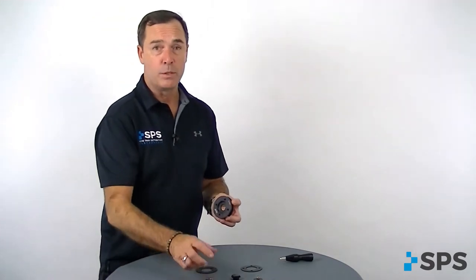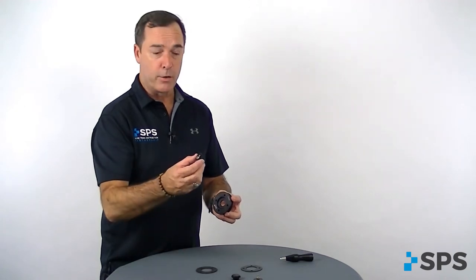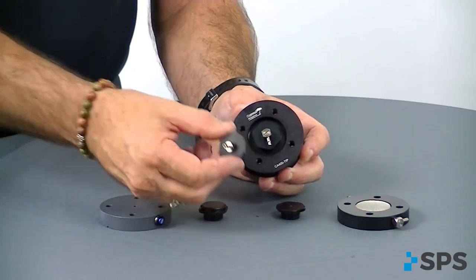You also have two choices of barbs that will go along with whatever endoskeletal components you would use. You've got a 90-degree safety barb — the insert would screw in, and the neat thing is the barb actually still swivels. And then you've got a straight barb.